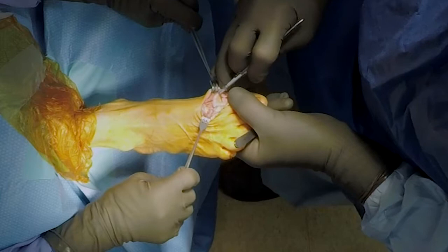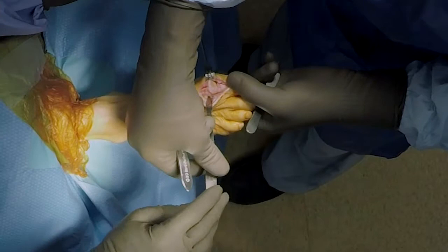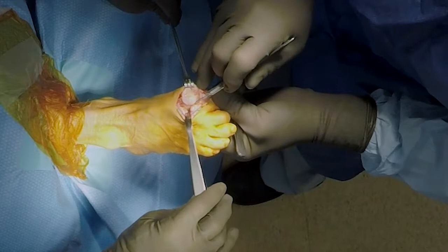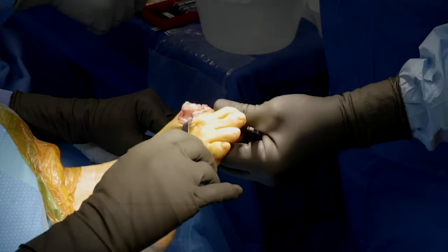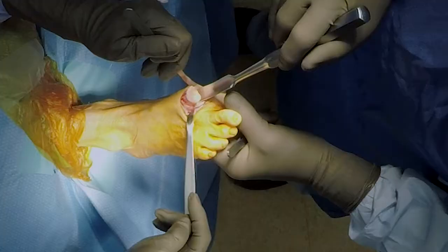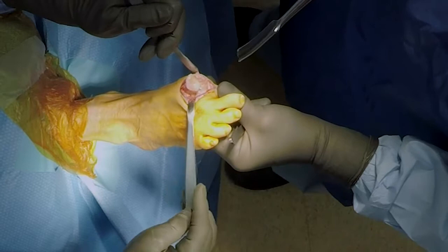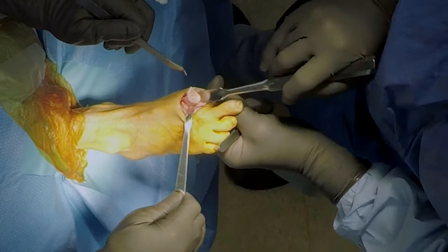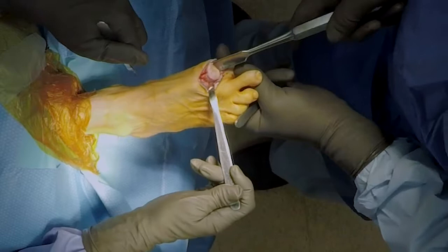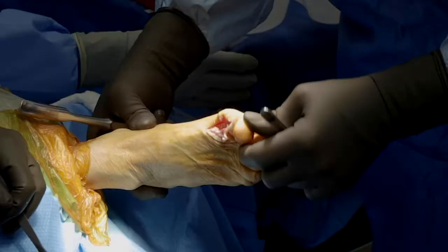I'm literally peeling it down off that medial side. Once I do that side, I'm going to do the exact same thing on the other side. Here's the other groove for the sesamoids — I put my knife in and literally come right around, scraping the metatarsal head. Now I essentially glove the area. I take my gouge, get it past the articular surface of the metatarsal head. Plantar flexing the great toe down gives you a nice space so you can get behind the head of the metatarsal and run this up, degloving it as a soft tissue sleeve without hurting the articular surface plantarly. Just by doing that you can start to get more motion.